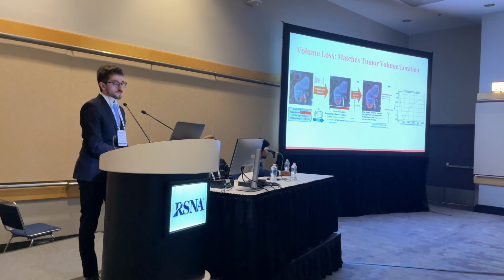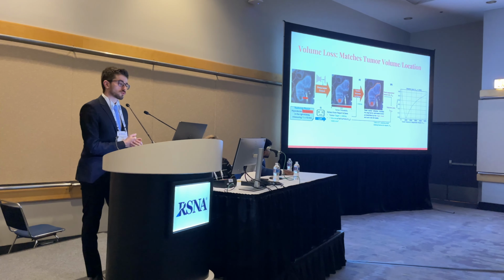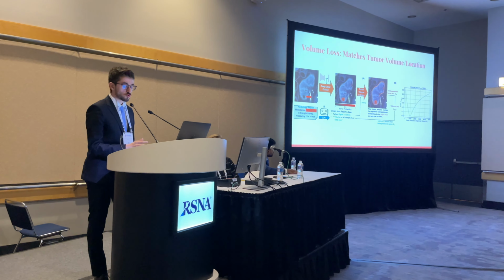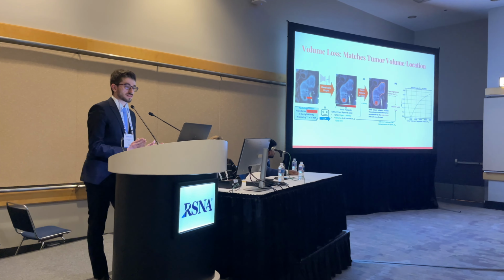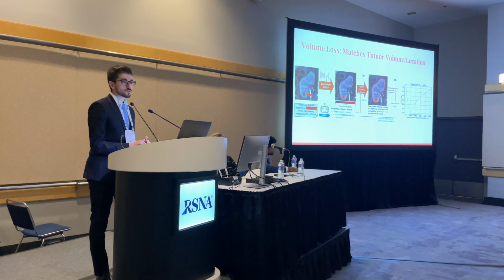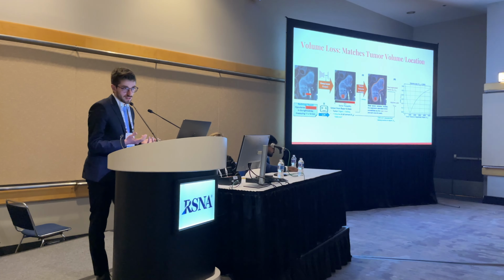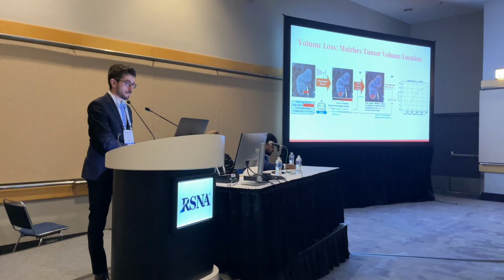This loss function has a special shape, so it has a strong penalization if the model does not find any tumor but there is a tumor, and it has a tolerance. So if the model predicts a size that's similar to the reports, we don't penalize it, because the tumor diameters are not perfect in the report, so we have a margin there.